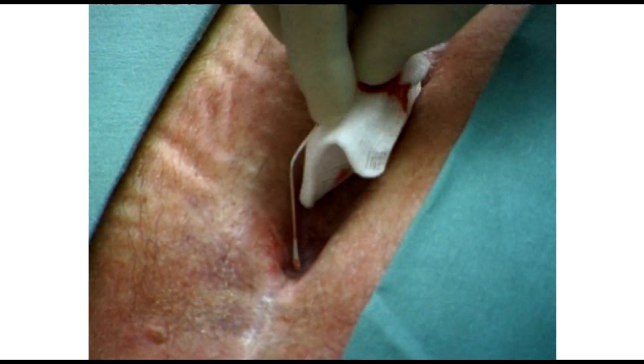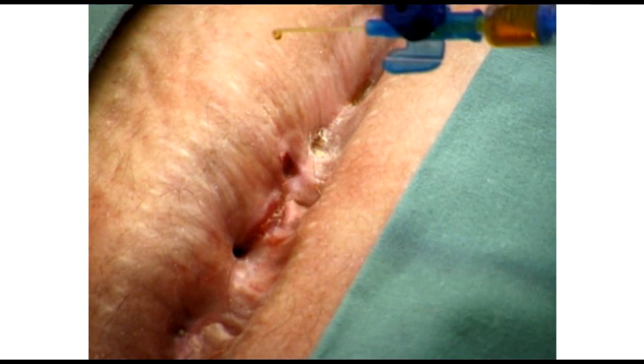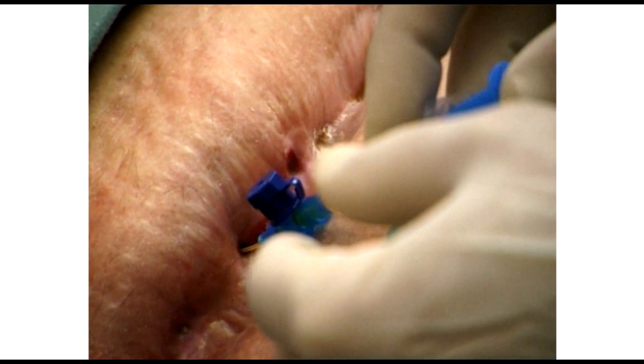A probe can show us the residual cavity above the right cardiac ventricle where the rupture was treated with a skin graft. The other fistula is above the remaining breastbone.